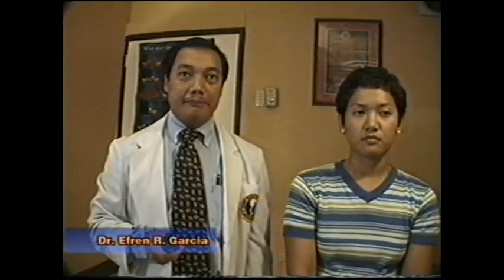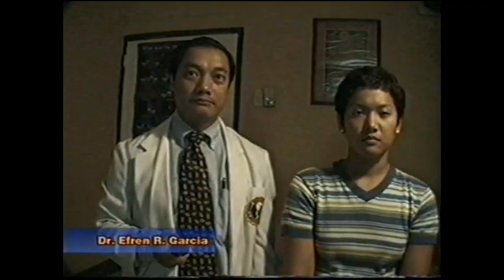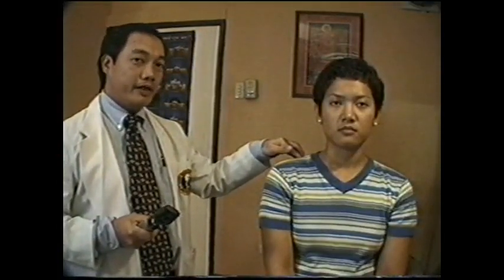Techniques in doing direct ophthalmoscopy. The patient is examined in a dimly illuminated room. As much as possible, a fixation light is provided so that the patient does not look at the ophthalmoscope light. It is preferable to examine the patient while seated.